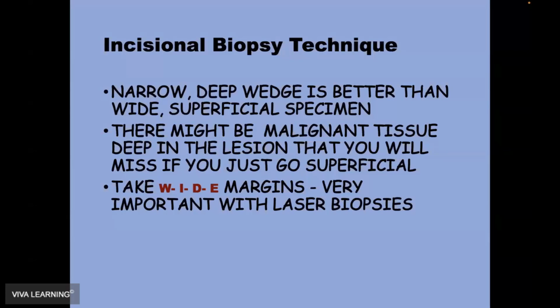You take wider margins. You go a little bit further out. That way, if you accidentally use higher power settings, you're not going to affect the margins, and you won't affect the pathologist's ability to read the specimen. So you're going to take wider margins with electrosurgery, radiosurgery, and lasers, and anything similar to that. With blades, you can take more narrow margins.